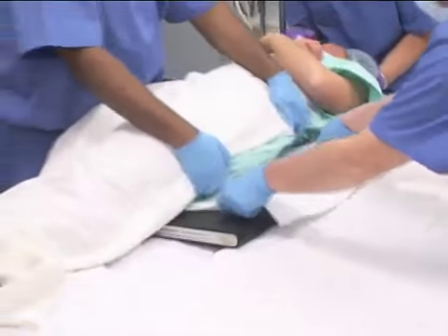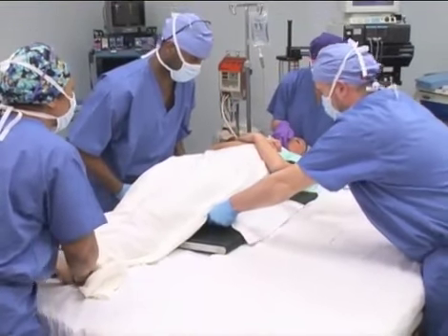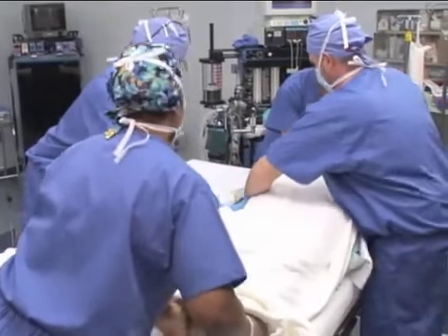An important role of the circulator is to safely transfer patients to and from a variety of conveyances, including stretchers, beds, wheelchairs, and the operating table. The transportation and positioning of patients in the healthcare setting is among the responsibilities that creates the most risk for patients and care workers alike.